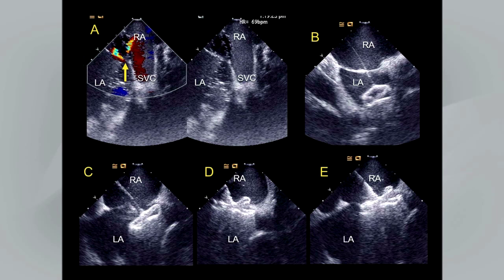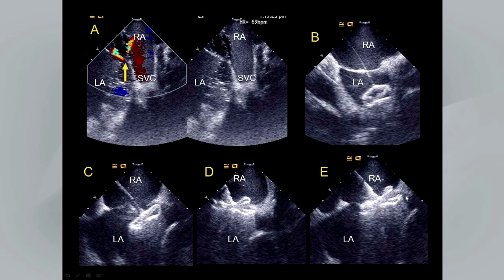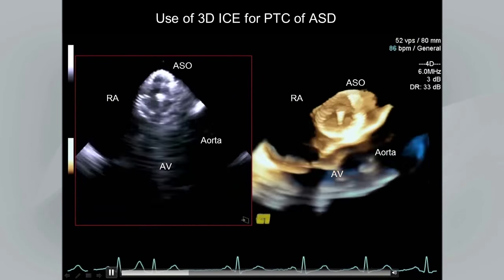In an ICE-guided ASD closure, a guide wire is placed across the defect into the left superior pulmonary veins, then a guidance catheter is placed into the left atrium. A balloon is positioned equally in the right and left atrium across the ASD and slowly inflated with a wide color Doppler window. Once cessation of flow is confirmed, we measure the waist of the balloon to determine defect diameter. The chosen device — in this case an Amplatzer device — is then deployed with the left atrial disc opening and being withdrawn back to the interatrial septum.